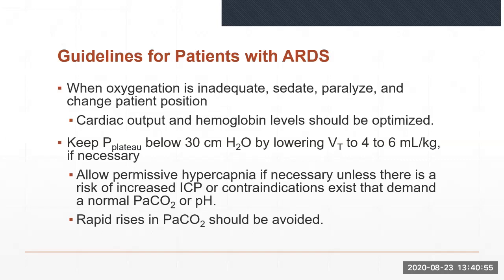There is no evidence to date that pressure control CMV is superior to volume control CMV or vice versa. The selection of one mode over the other may depend on clinician comfort levels. If VC-CMV is selected, the clinician should use the descending flow waveform to help ensure early delivery of tidal volume and provide a higher mean airway pressure than a constant flow pattern, which may benefit oxygenation and minimizes the difference between PIP and plateau.